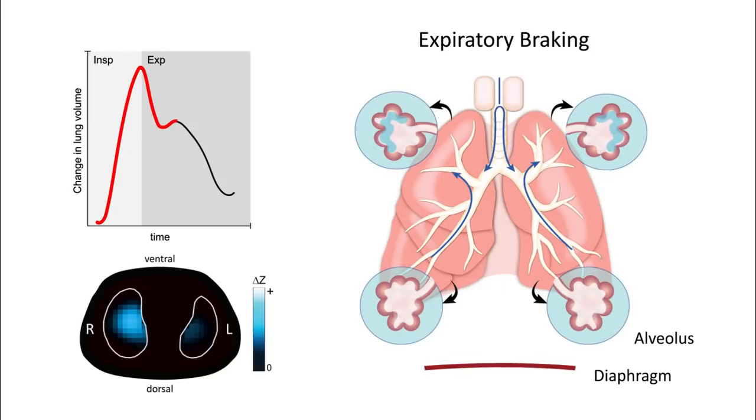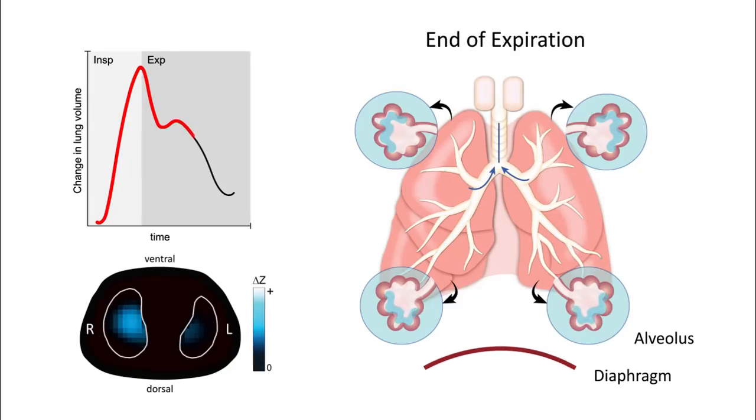The subtle but important movement of gas within the lungs during expiratory braking is something that has only been possible to see with our EIT methods. This represents a type of pendular flow in which the stable aerated lung regions redistribute gas to those alveoli at risk. Once the interstitium has been cleared of fetal lung fluid and stable functional residual capacity established, regular tidal breathing can occur.